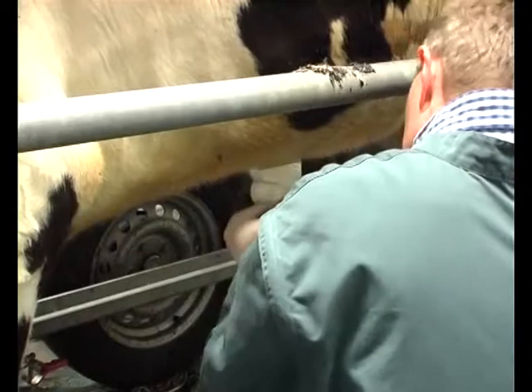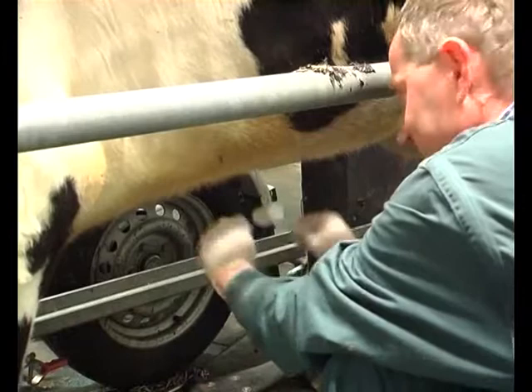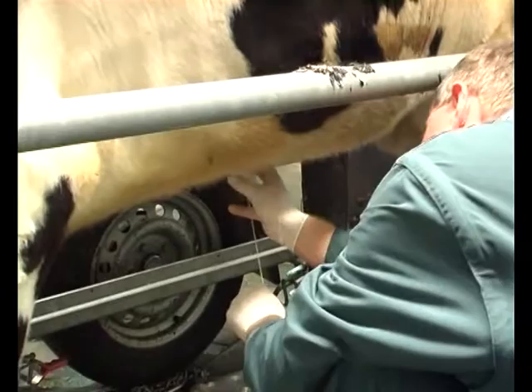Okay, now I try to pull the abomasum like a fish. And I must say there's very much power on the fish now. We can have a look if the abomasum has disappeared, yes or no? Okay. Right. It's all right. I can see the black marks now.